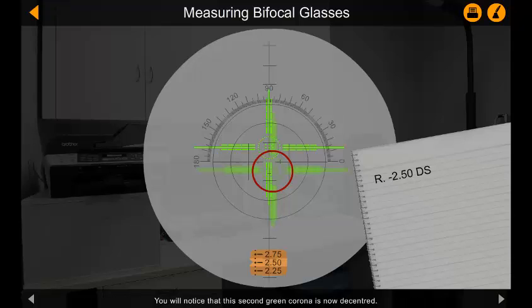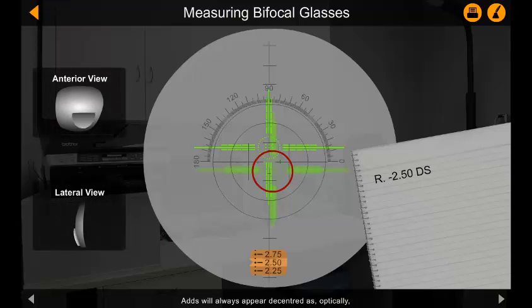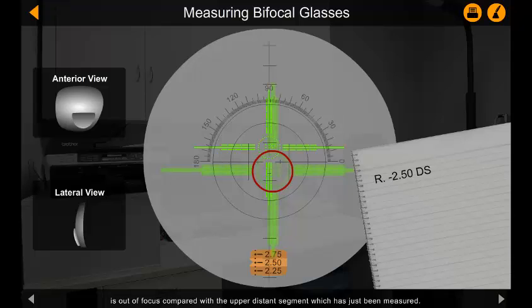You will notice that this second green corona is now decentered. Adds will always appear decentered as optically they are not centered on the lens. This is acceptable. You will also notice that the lower corona is blurred. This is because the add, or lower segment of the bifocal lens, is out of focus compared with the upper distant segment which has just been measured.